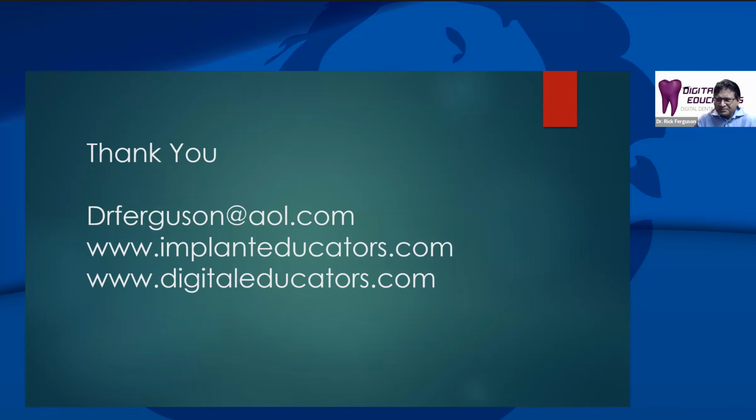I was actually going to comment, Rayface, I think, is finishing a direct bridge from their software to Blue Sky Plan. Awesome. And I think they also have advanced functionality in terms of merging everything together. So you get the CT, the face scan, the models, everything merged in their software, and then transferred as a unit to Blue Sky Plan. I love that they're doing that with a third party like Blue Sky, because I know Carestream has that on their 9600 machine, but it only works within their ecosystem.